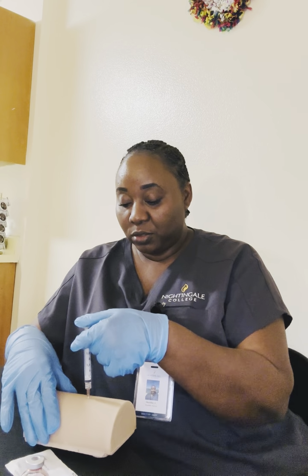before taking out the needle. Take out the needle, put a gauze over the injection site, and apply a little pressure. I'm not going to massage. For the needle, I'm not going to recap it; I'm going to dispose of it inside the sharps container or a biohazard bag. If it's a safety needle, I'm going to activate the safety feature and still dispose of it. The needle will not be recapped.